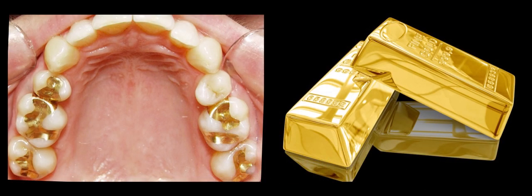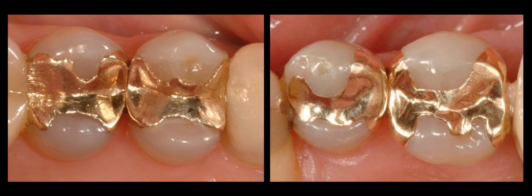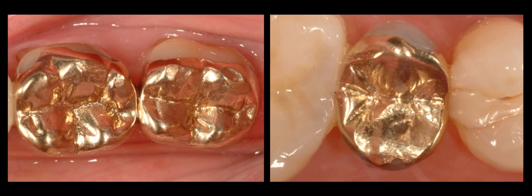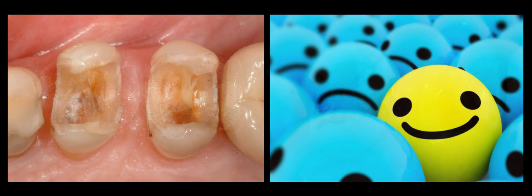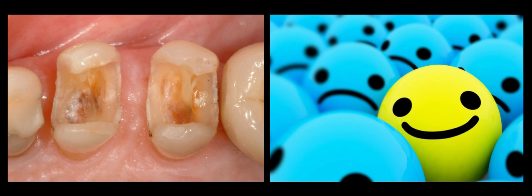This is maybe due to my prosthodontic background but I think indirect gold restoration is the best our patient can have. We've all seen cases of gold inlays and onlays or overlays that have performed extremely well in the course of time. Of course it comes a time when the gold can be abraded or we may have discrepancy in the margins, but when we remove them as we see here in this case that served the patient for about 45 years, after initial caries removal we've seen all the tooth structure that has been preserved.